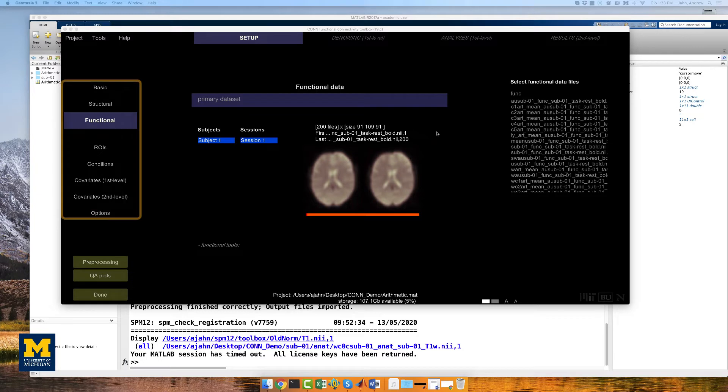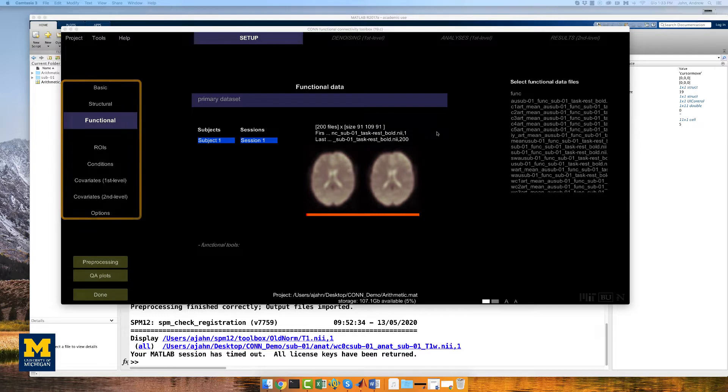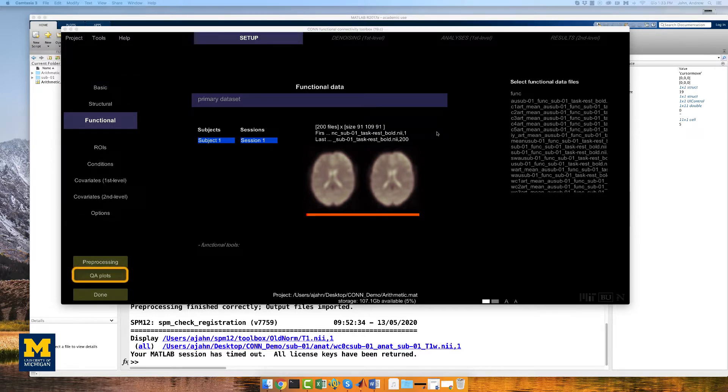We will first use the buttons on the left side of the CONN GUI to examine the output of some preprocessing steps, and then use the QA plots button in the bottom left of the CONN GUI to create a comprehensive QA report.